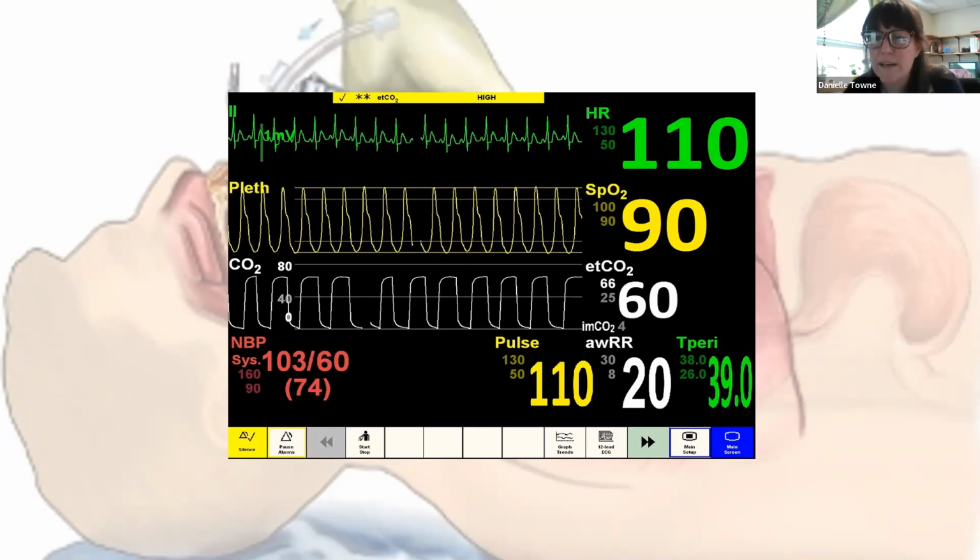We want to make sure that end-tidal CO2 continuous waveform capnography is still connected and still functioning. We want to watch our SpO2 closely as the patient's being transitioned to the ventilator. If they have a dip in their SpO2, we can think about increasing their FiO2, their PEEP, and they might even need their respiratory rate increased based off what they were breathing before. And again, don't forget next month, our vent management lecture, we're going to go into a lot of this in more detail.